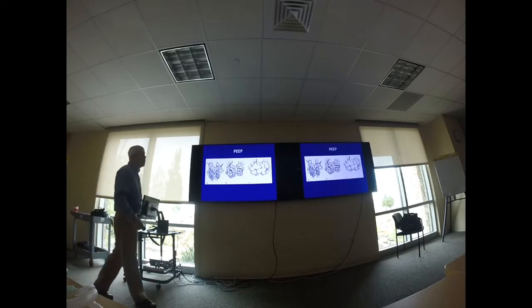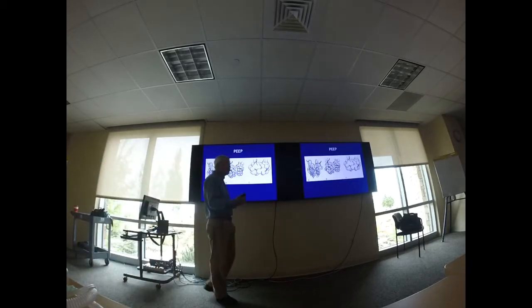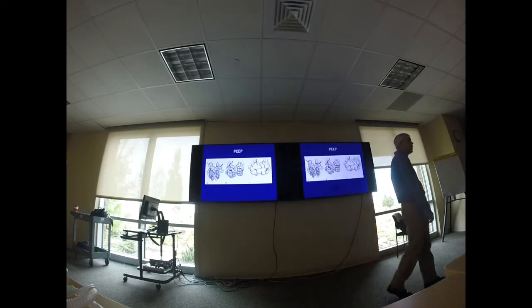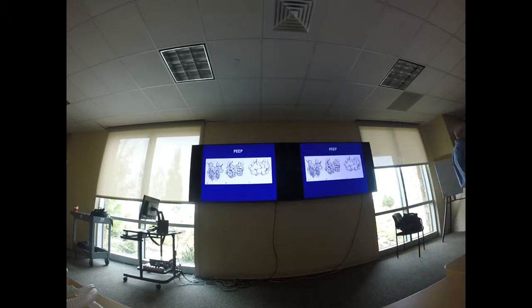According to our protocols, how much PEEP can you administer to a patient before you start to call in for medical control and all of that kind of stuff? Isn't it 15? Yeah, so if I was above 15, I definitely would start to call medical control. And really 10, I would be starting to think, what's going on with them, right? And so what are some indications where you might use PEEP on somebody?